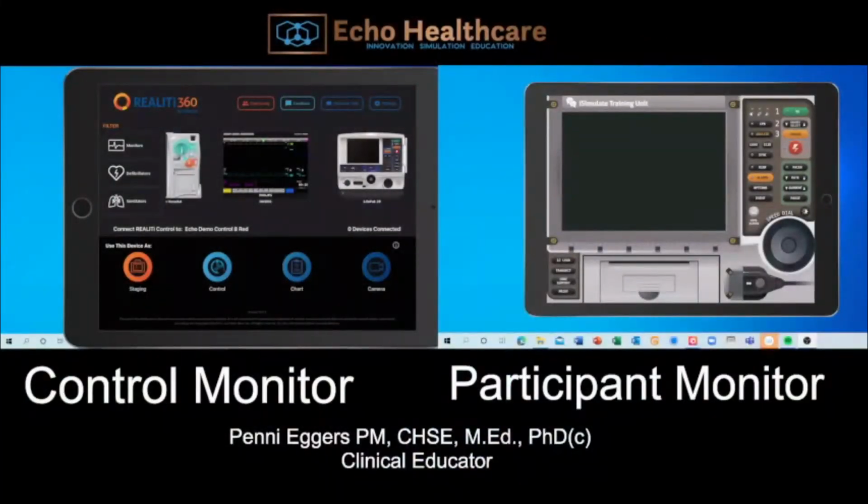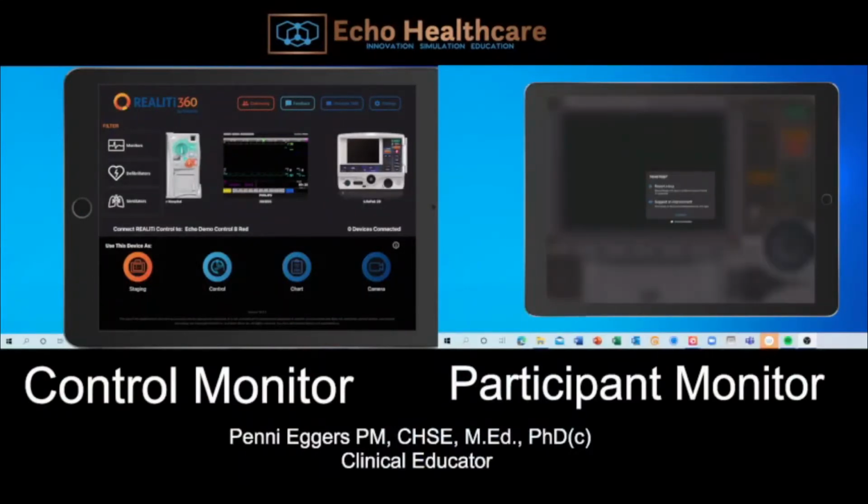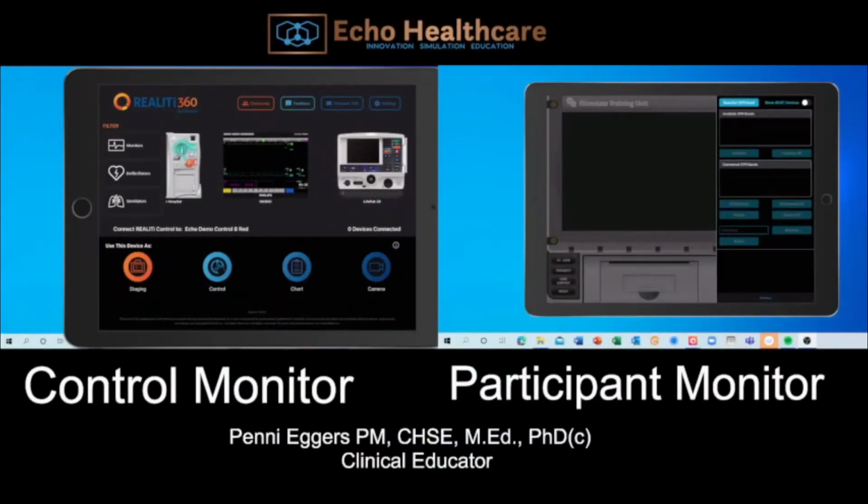I'm going to go to my participants monitor. I'm going to touch the screen on the right-hand side and swipe to the left. This is going to bring up my CPR band page. I'm going to scan for bands by just tapping on Scan for Bands. I see that the band shows up in my dialog box. I'm going to just tap on that. It highlights it in gray. I'm going to connect. Now it's going to put it down into the connected CPR bands. It also will show you your battery life. Now I'm ready to go. I'm connected.